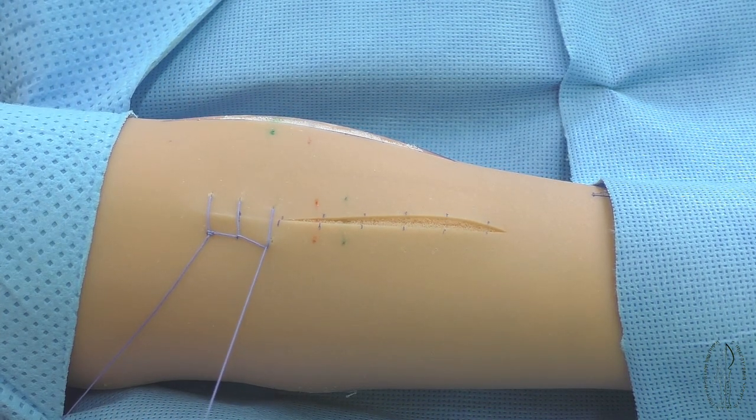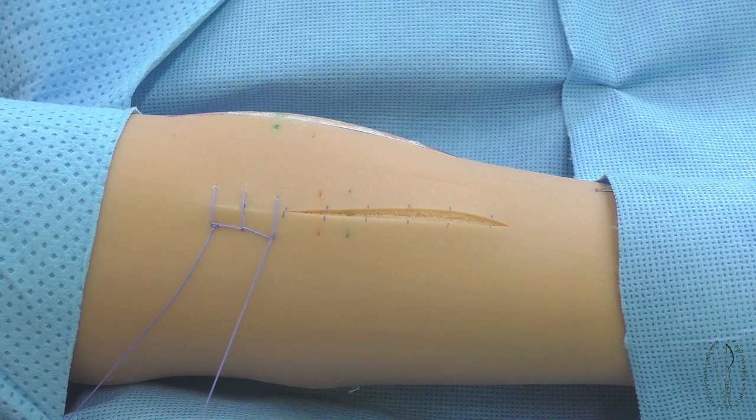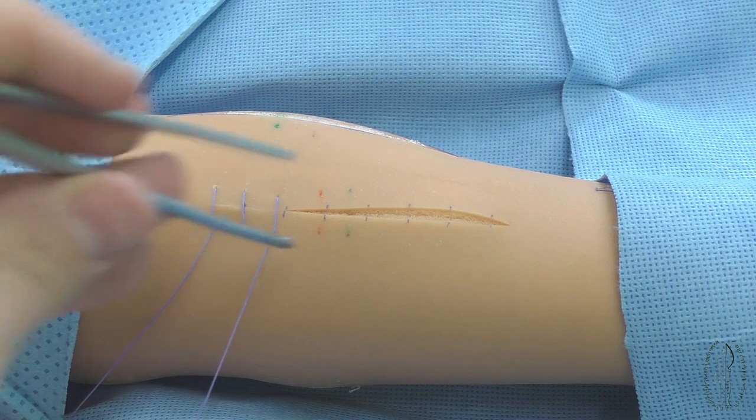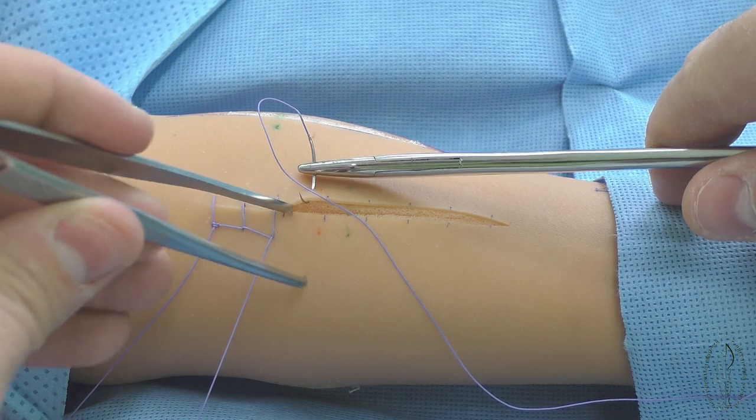Subsequent stitches are made in the same way. For prevention of the divergence of the wound edges at making subsequent stitches, an assistant keeps the filament stretched in the direction of the needle output.